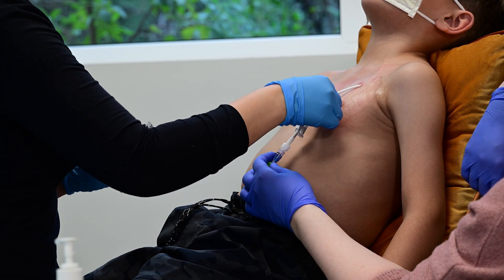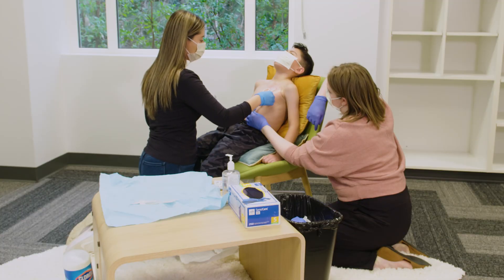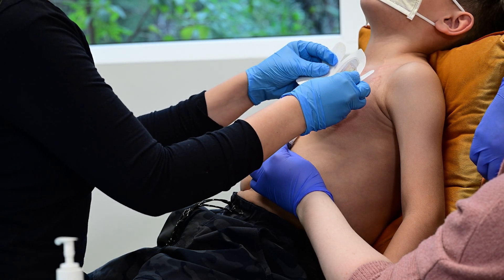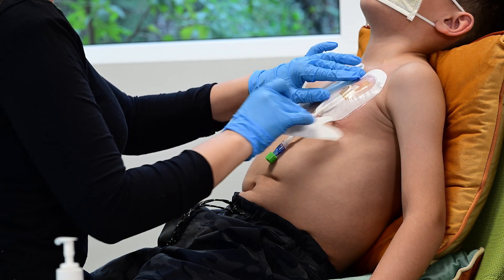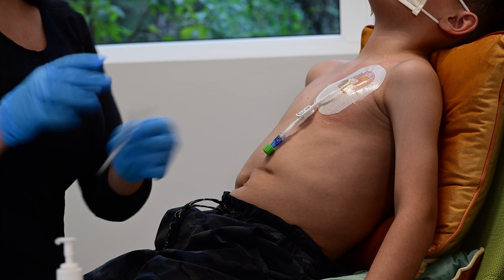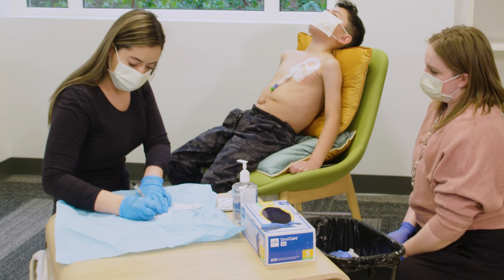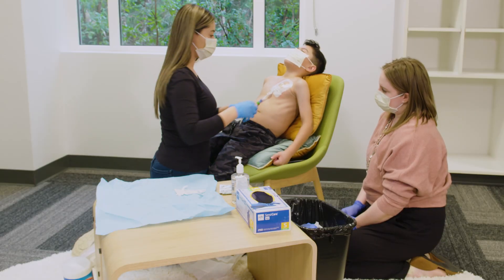Save the skin barrier for the last step to secure the dressing around the edges. Make a loop in the central line if recommended by your care team. Apply the dressing over the central line, making sure that the gel pad covers the insertion site. Finally, remove the paper border of the dressing and smooth down the edges. Write the date on the dressing so you can remember when it was last changed. Add the leftover skin protectant along the edges of the dressing.